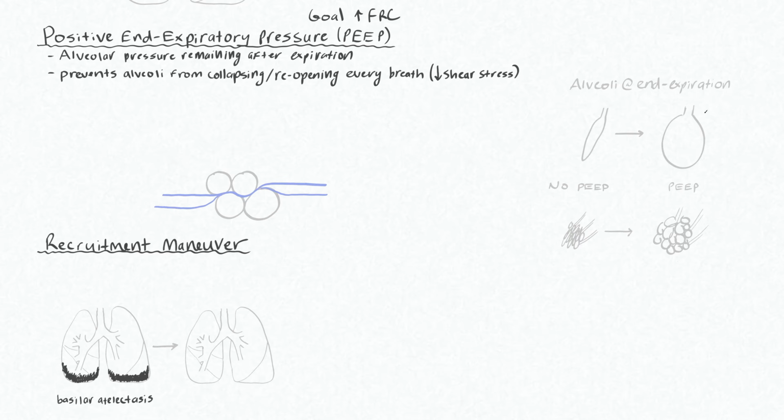Now, there's both natural or auto PEEP, which can happen with asthma and breath stacking, or there's extrinsic PEEP, which is what we're applying with the ventilator.